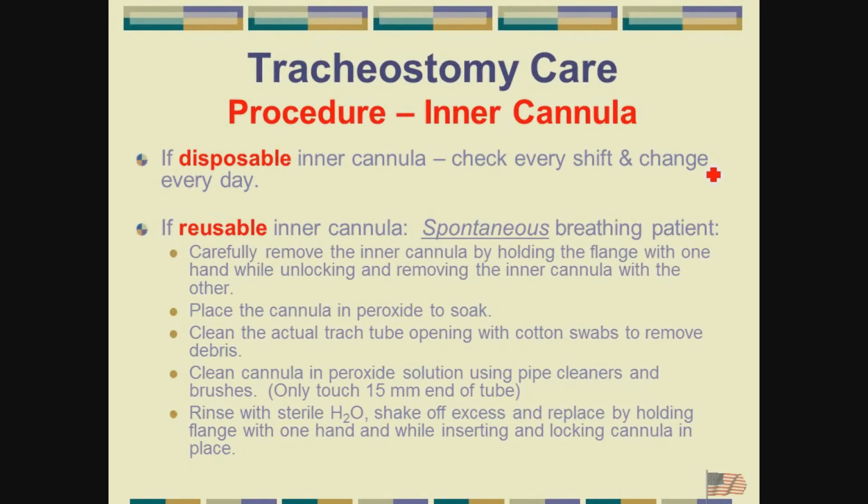Go ahead. At this point, is it still a sterile procedure or both? No, it definitely is a sterile procedure. One hand sterile, one hand non-sterile. What are you removing the inner cannula with, non-sterile or sterile? Non-sterile, because it's been exposed there. It's not so much the 15 millimeter adapter, that's never going to be sterile in this case until we put a new one in, but once you hook something back up to it, it's no longer sterile. It's the cannula itself that we want to maintain sterility on. Okay.